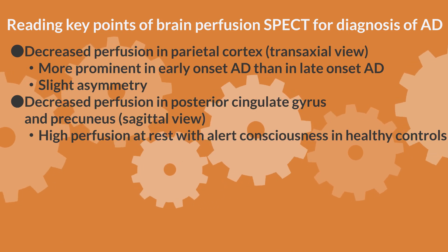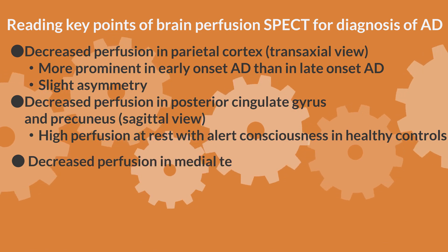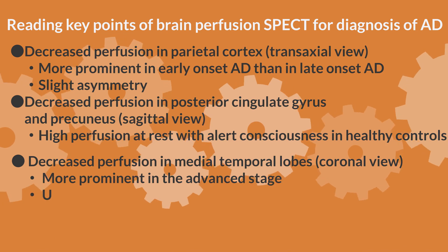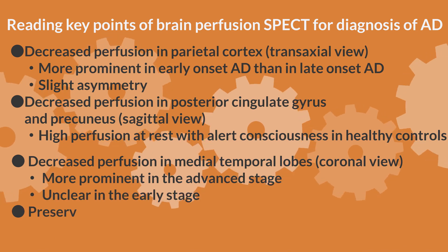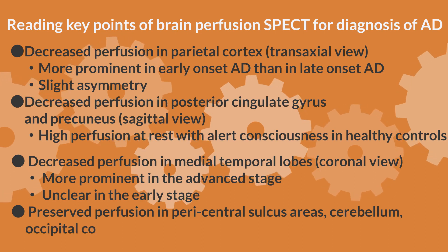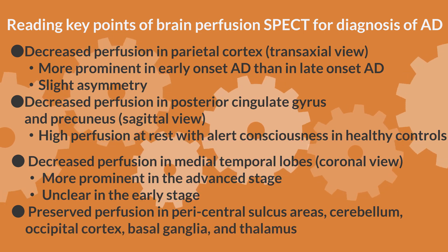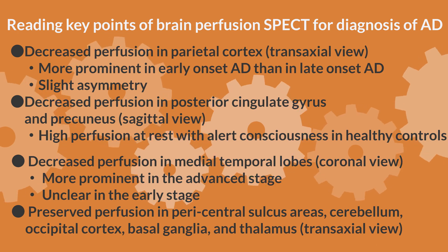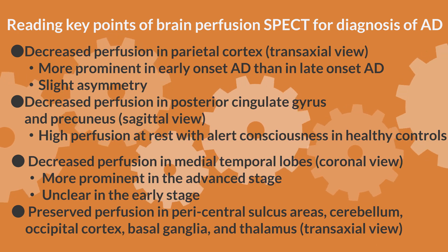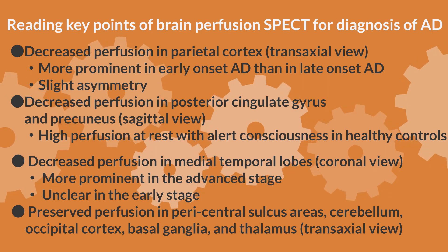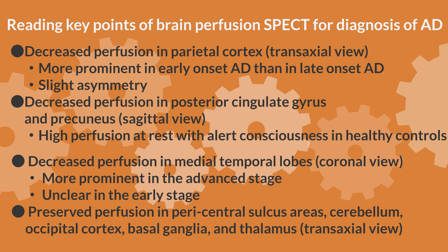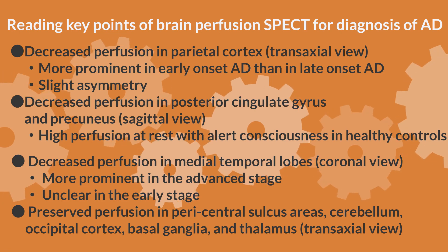Reduced perfusion in the medial temporal lobe can be determined by coronal sections. However, despite the presence of atrophy, hypoperfusion in this area is often not evident in early stages; in advanced cases, there is a perfusion decrease. It is important to note areas where perfusion is preserved: pericentral sulcus cortex, occipital lobe, cerebellum, basal ganglia, and thalamus should be assessed on transaxial images for preserved perfusion.